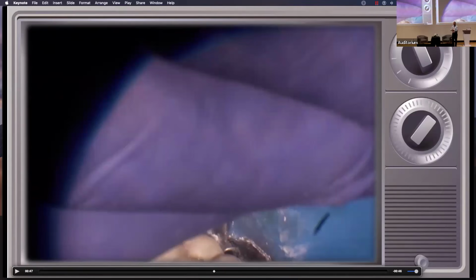And when the file stops advancing, something's happening. Either the flutes are loaded up, it's encountered an obstacle. Hopefully that obstacle isn't the broken off tip of the file in there. These are so tough though. So I'll go in, and if you remember one of the earlier videos, I pulled it back and shook on the file a little bit with lubricant in the canal, bleach in the canal, that'll take some of the debris that's stuck on the flutes of the files. Because these files are so small, there's very little chip space in there and they load up quickly, especially if you're cutting with them.